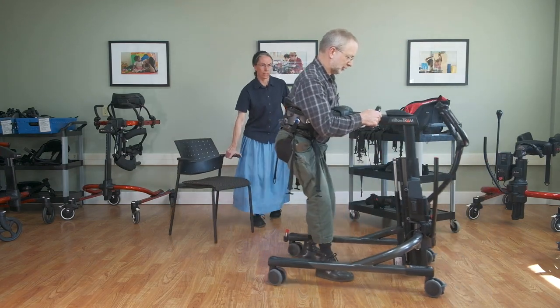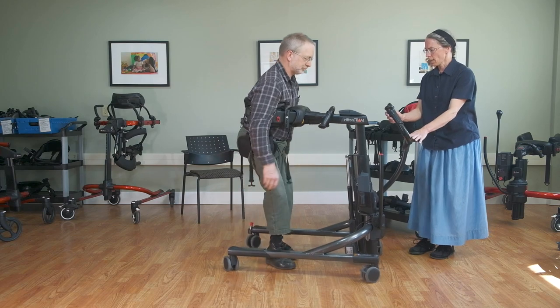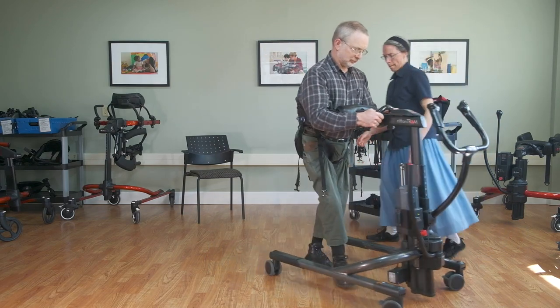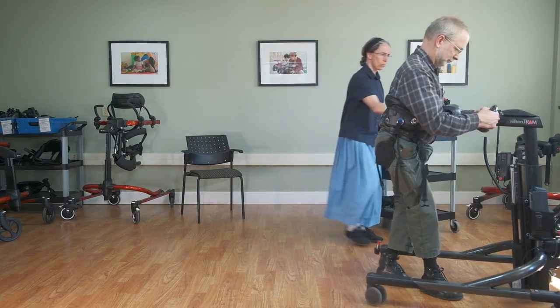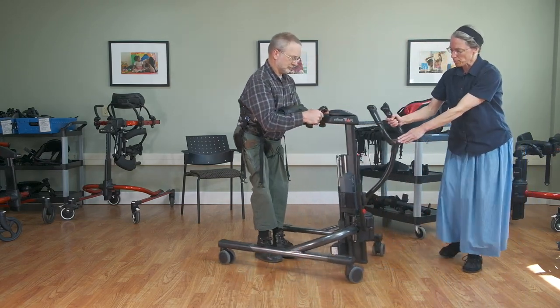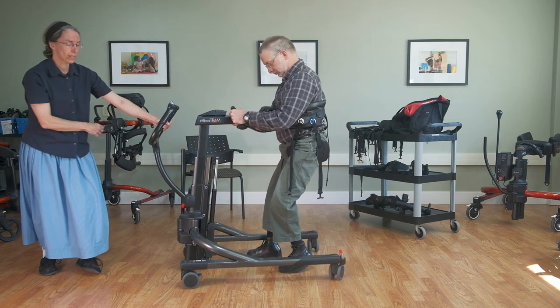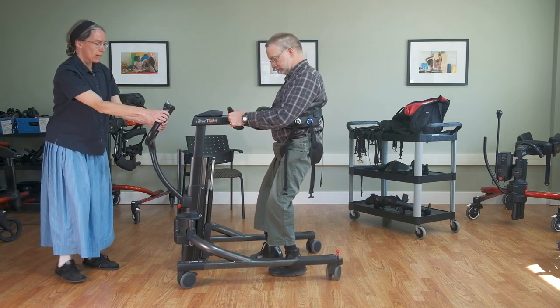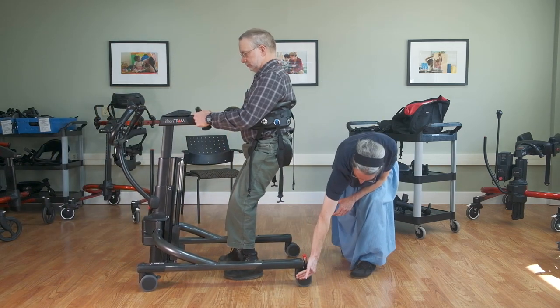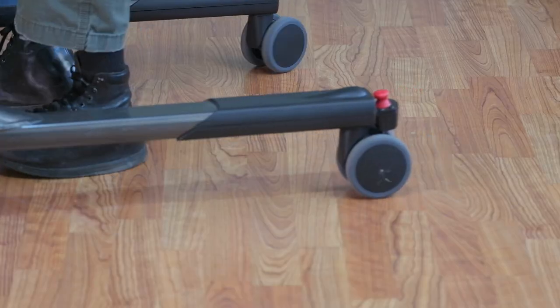The whole device weighs about 70 pounds and it's very maneuverable — you can provide guidance from the front. There's definitely no fall risk; the user is fully supported. The rear caster has an optional direction lock which can be set in place to assist with steering.